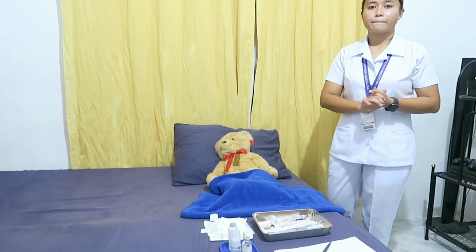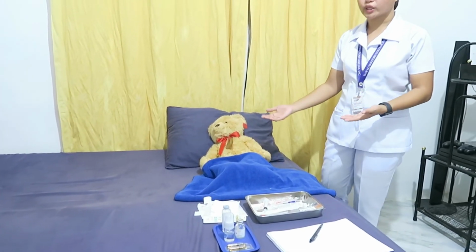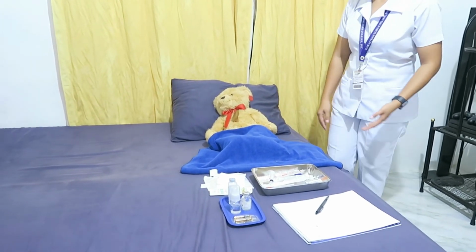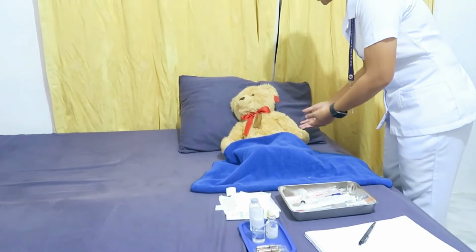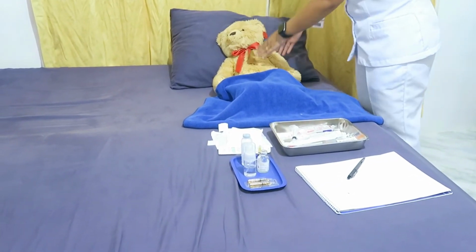So, the next is to prepare the client. The rationale for that is, this is to ensure that the right client receives the medication. Okay, ma'am. So, are you okay with your position, ma'am? Alright. Okay, ma'am. Thank you, ma'am.